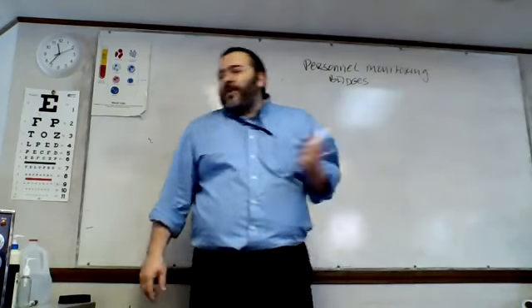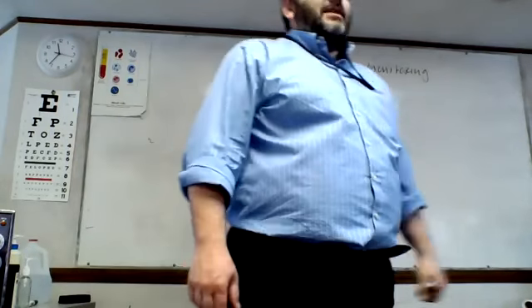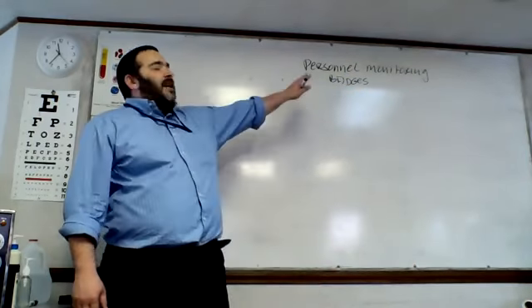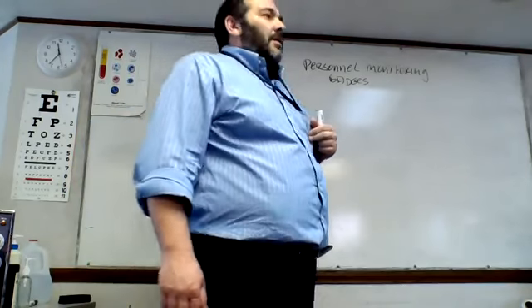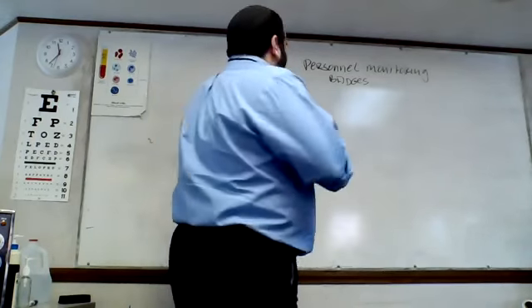I'm sure you've had x-rays taken in the hospital and you've seen technicians that work in that department wear little badges. And they go, oh, what's this? It's a radiation badge. Well, we have similar badges when we are working in the area where there's ethylene oxide. The thing that you need to know about this is that it needs to be worn in the breathing zone.